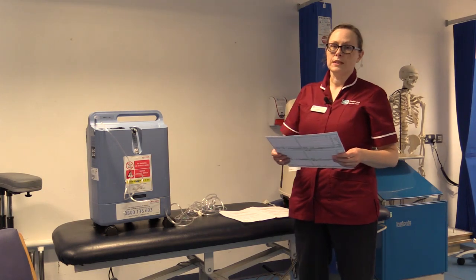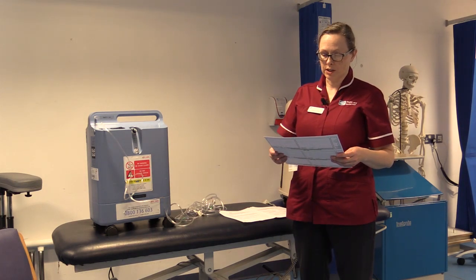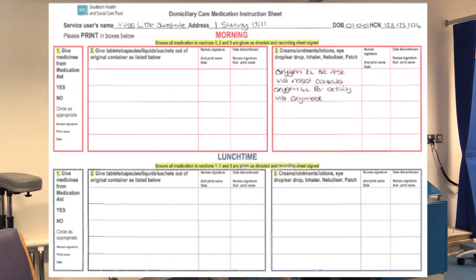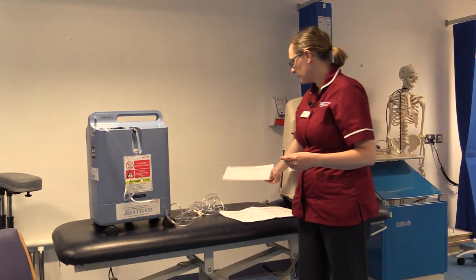When you arrive at the house, you need to ensure that the oxygen is prescribed. This will be on your domiciliary care medication instruction sheet. You will see from the first one that the patient is prescribed oxygen 2 litre via nasal cannula. So that will be for rest or activity. The second one, you will see oxygen 2 litres at rest via nasal cannula, and then oxygen 4 litres for activity via oxy mask. So that is for a patient who will be using 2 litres when they're sitting at rest or 4 litres for activity.